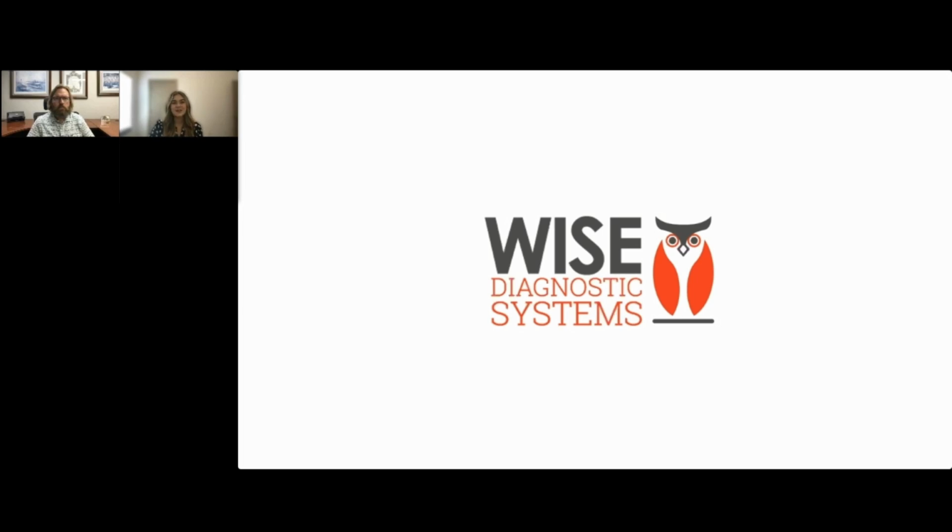The first question we have here is, in your experience, why would a reference lab use TAC cards to process their infectious disease samples? I think the TAC card system is a great option if you have a test that is lower throughput, or if you're getting started and want to keep your testing costs as cost effective as possible. For example, we have a test that we continue to run on the TAC card system because it is only ordered a few times per week or so, and it allows us to continue to offer that test and keep our costs down.